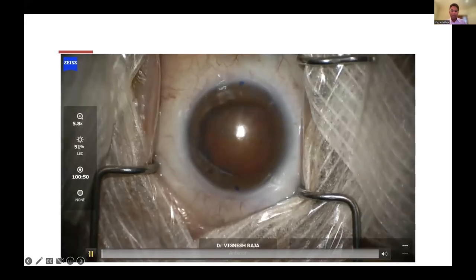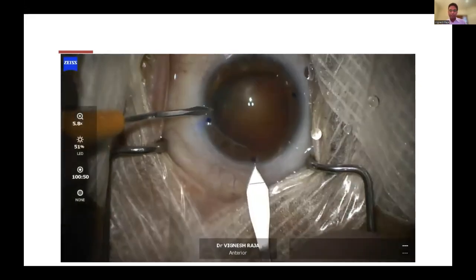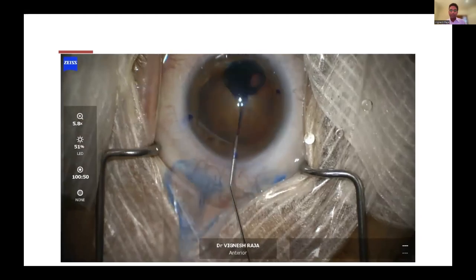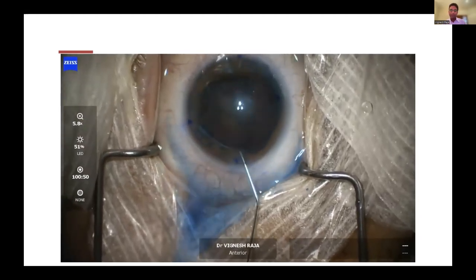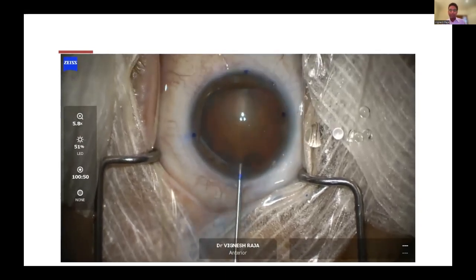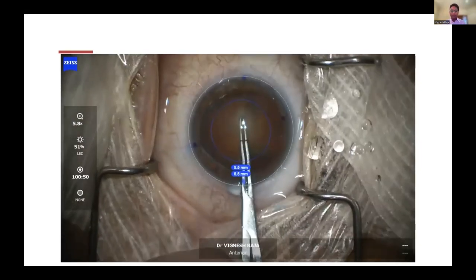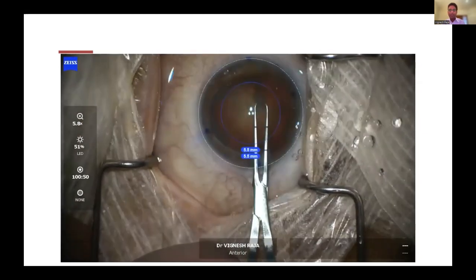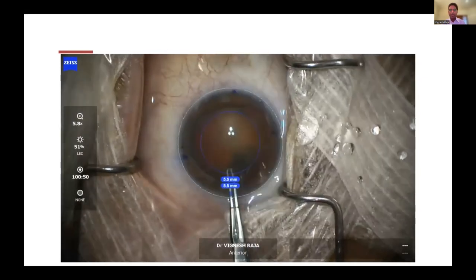So this is a case where the patient has a fixed dilated pupil like this with a dense cataract. I thought the pupil was too big to do any pupilloplasty, because this is the size of the pupil even undilated. And he's got a dense cataract there. Here I'm planning to implant it in the capsular bag. You don't want to make it too big or too small, because as you get capsular phimosis, you don't want it to buckle the material.